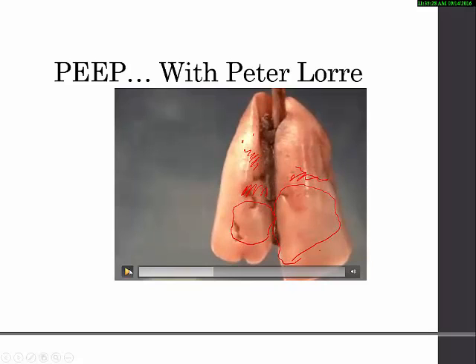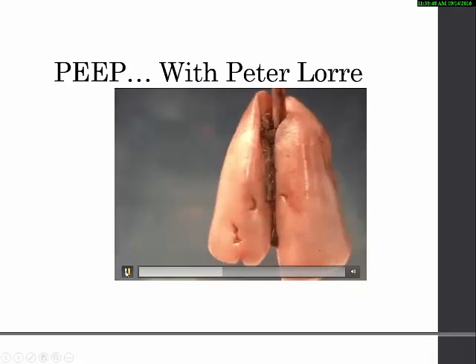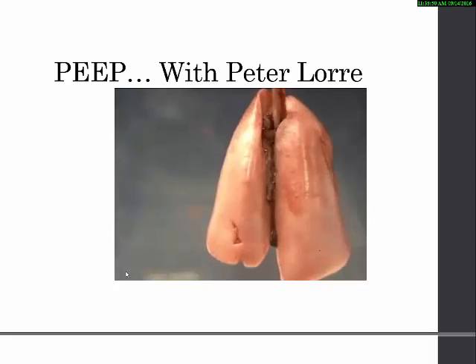All right, see how pretty that is. So all this lung tissue now is inflated. So we don't have any more of these areas that are deflated, and this is going to give us a full use of the lung tissue, which means that the patient is going to now have good airflow in and out and good oxygen and carbon dioxide exchange. When he takes the PEEP off, again, you're going to see a full deflation of the lung.